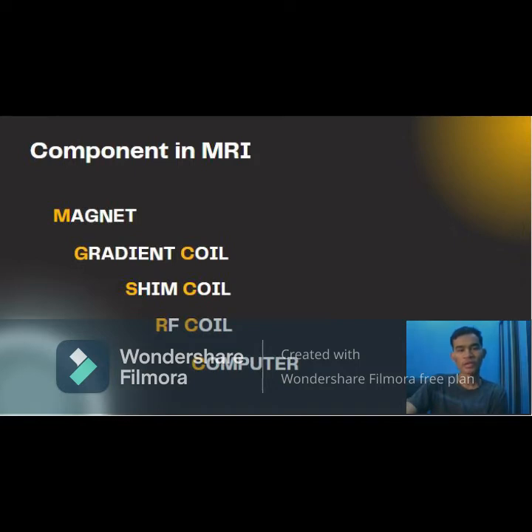And the last one is the computer. A digital computer is an integral part of an MRI system. The production and display of an MRI image is a sequence of several specific steps that are controlled and performed by the computer. The RF signal data collected during the acquisition phase is not in the form of an image. However, the computer can use the collected data to create, or reconstruct, an image. This is a mathematical process known as a Fourier transformation. This is relatively fast and usually does not have a significant effect on total imaging time.